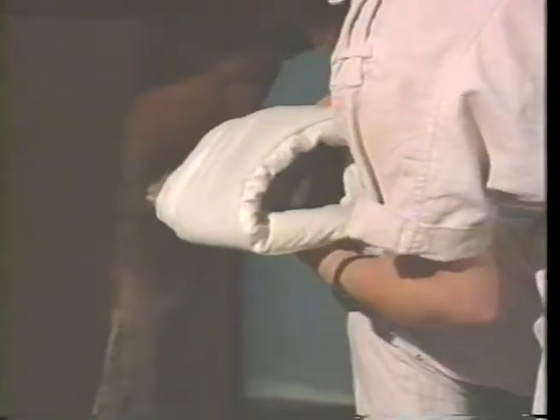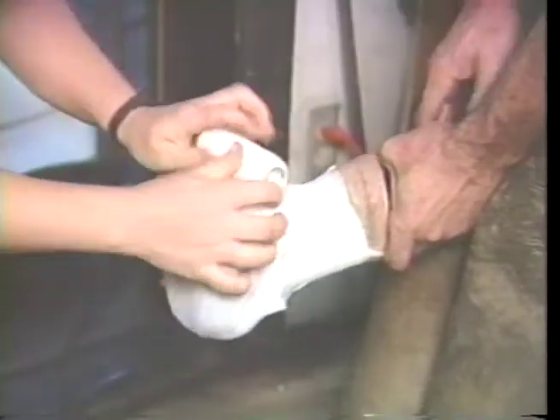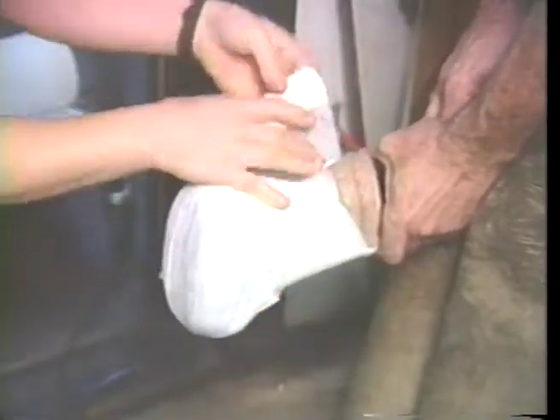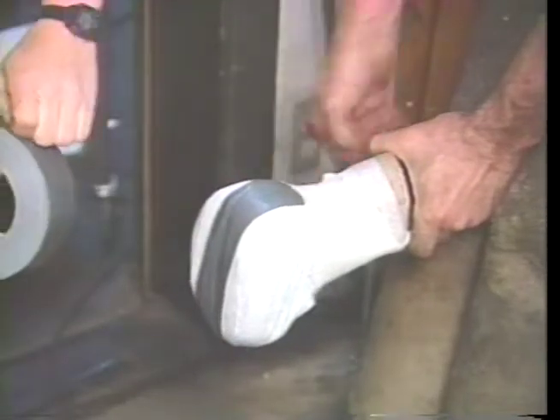I want to use the conformation of the pastern being smaller than the foot to secure the bandage. This way I do not have to put anything tight around the foot. So this medication is applied to the foot, this bandage material is laid down the back, across the foot, under the front, and use cling to secure it. Or you can just use vet wrap, making sure that there is always cotton — and plenty of it — between your vet wrap, your tape, or whatever you're using on the outside, and the coronary band.